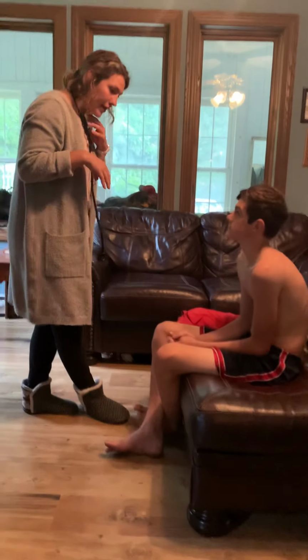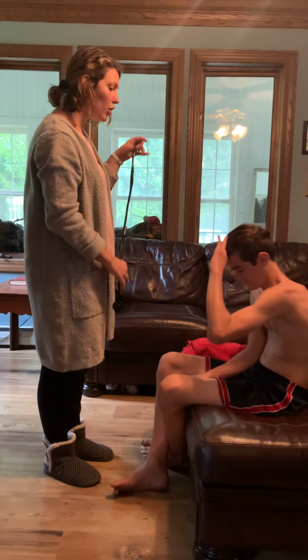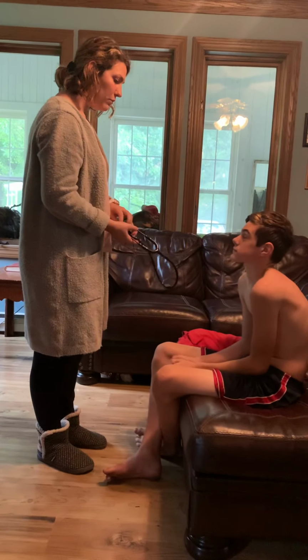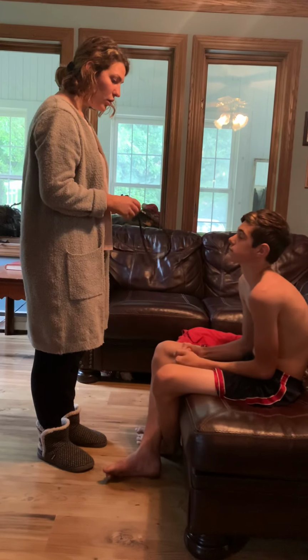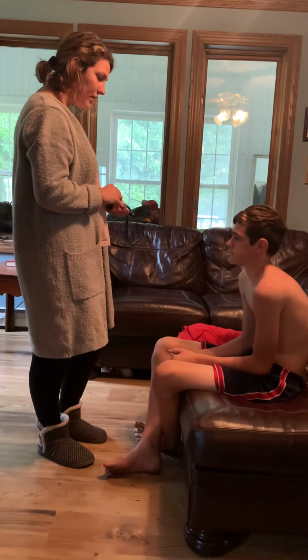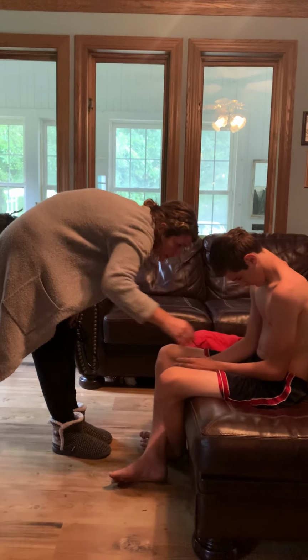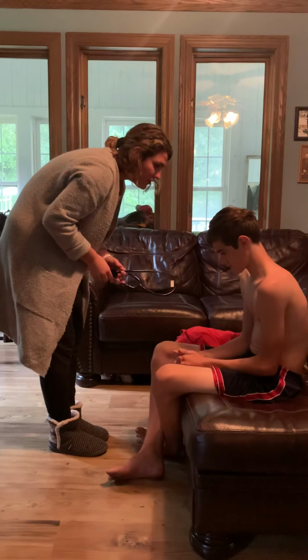Again, good, nice, clear lung sounds, equal bilaterally, no abnormal sounds, like no rales, crackles, or wheezing at all, so that's good. Your costal angle looks good as well, less than 90 degrees, which is normal, so that's good.